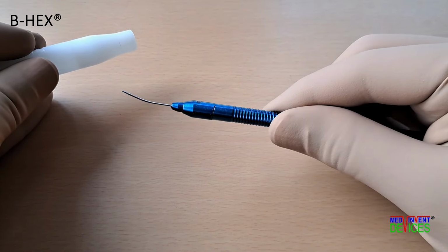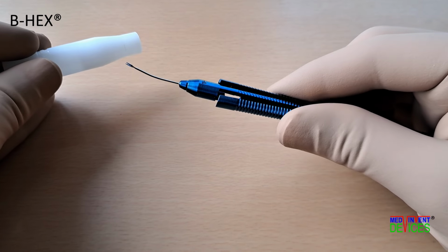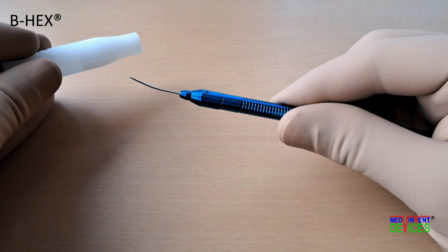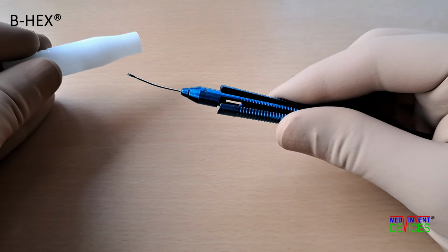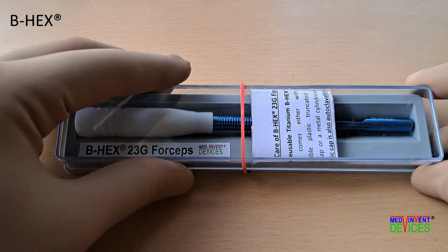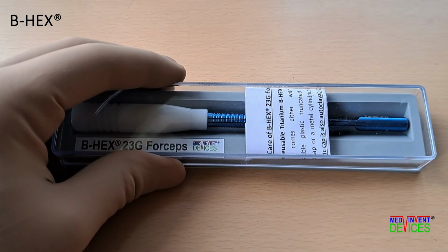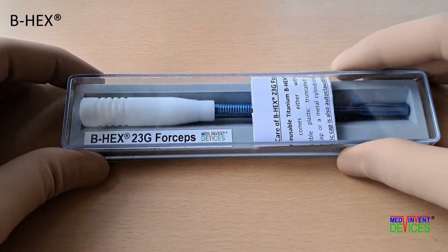The jaws open in a plane perpendicular to that of the squeeze handle, and the stalk is curved and short. A vitreoretinal forceps is not suited for this purpose. The B-HEX forceps is supplied in a hard case. The case should be placed on a table before removing the rubber band and transparent cover, so that the forceps does not drop out.